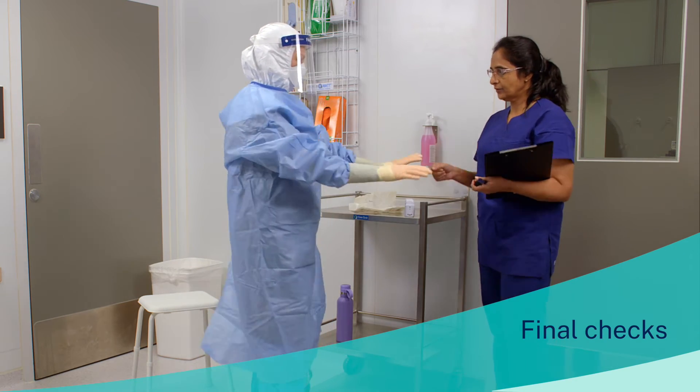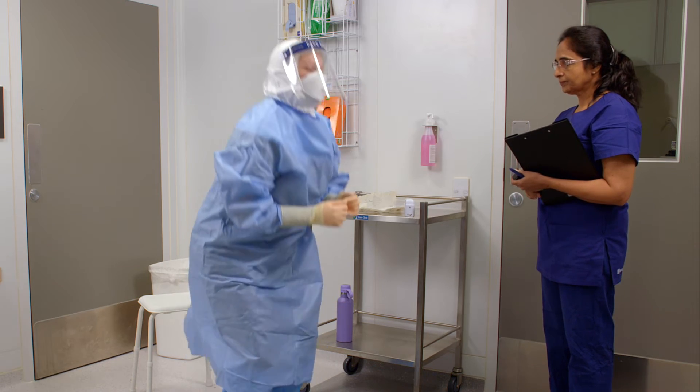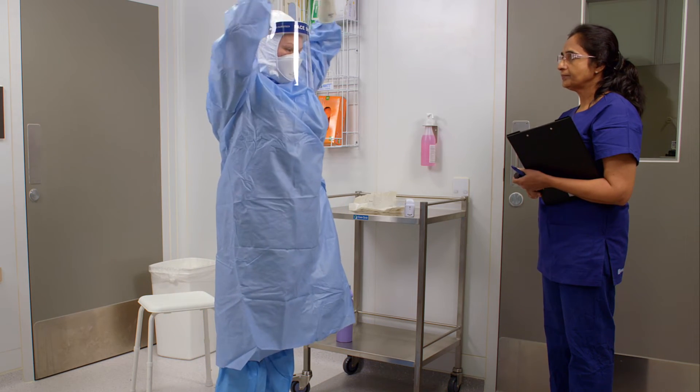Check for comfort by squatting, stretching, and shaking your head before entering the patient's room.